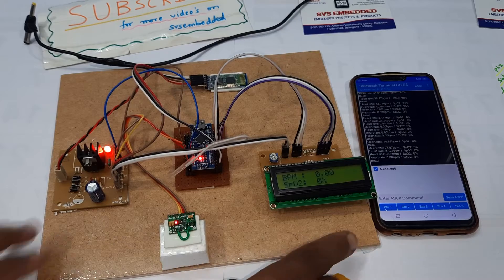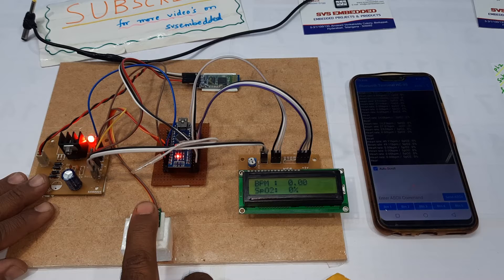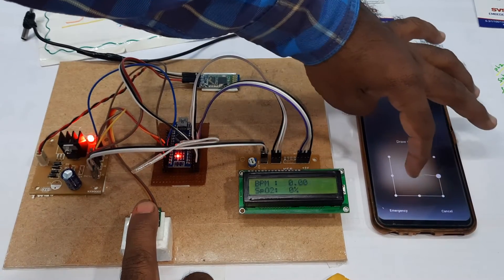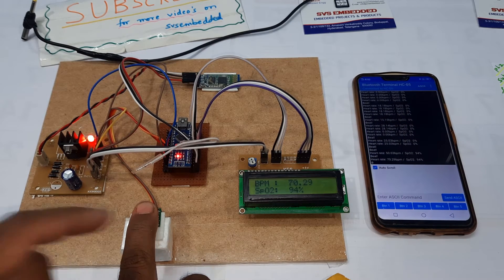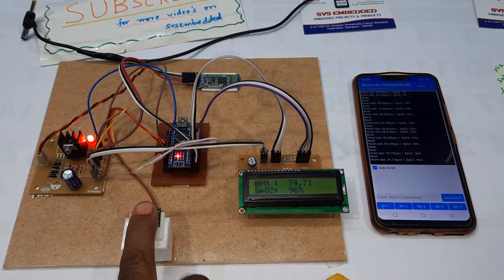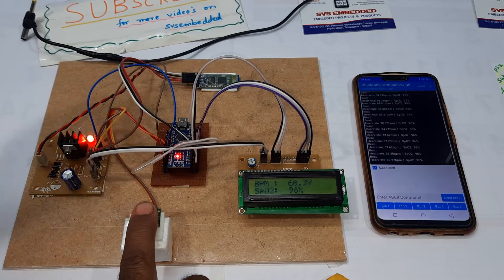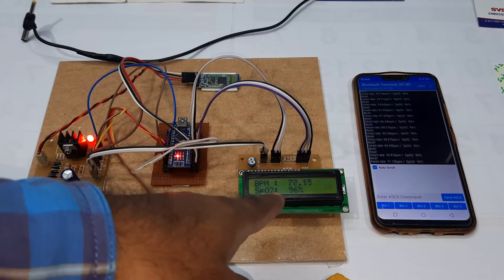Giving the power supply again. Readings displayed: heart rate 70, SpO2 94, heart rate 68, SpO2 95. Then heart rate 60, 70, and SpO2 96.